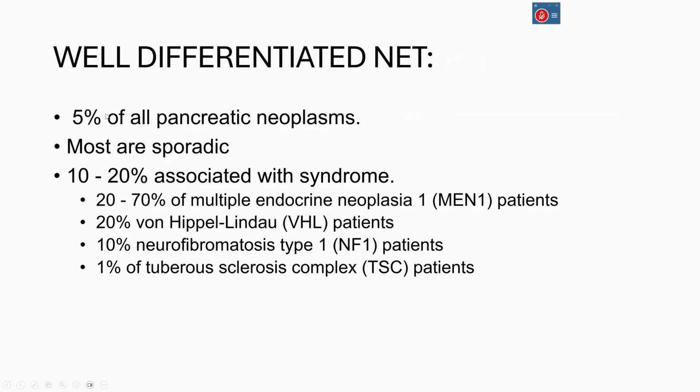We are calling it well-differentiated because the morphology is not of small cell or large cell carcinoma. We don't see that brisk mitosis or apoptosis, and Ki was also less than 20%. And in this case, I think just 1.5%.